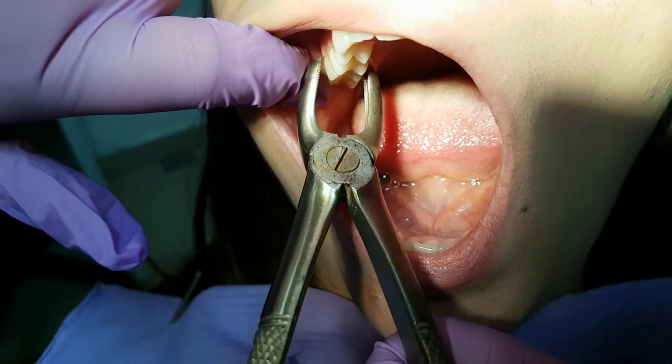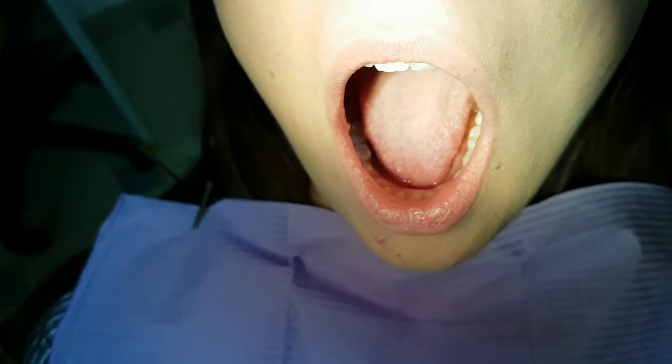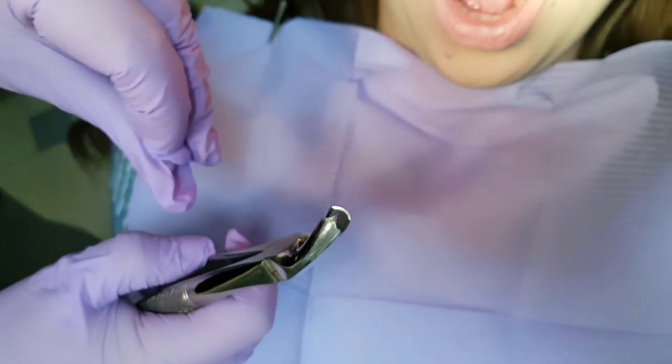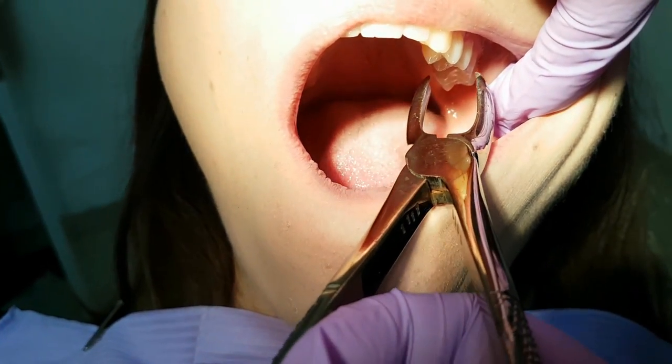This is how it looks in the patient's mouth. From the placement of the thorn we can see if the forcep we work with is left or right.